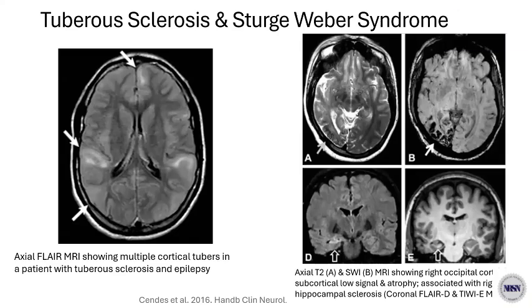Then one other thing I want to add is that the arterial spin labeling technique is particularly useful in children. I'm not sure I mentioned it. The reason is that in children, MRI has very poor sensitivity, because in children below 2 years of age, myelination has not been completed. So MRI is very poor in the detection of epilepsy, and in this case it can be supplemented by arterial spin labeling.